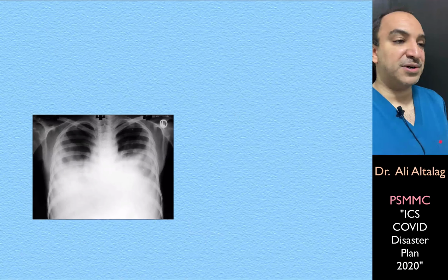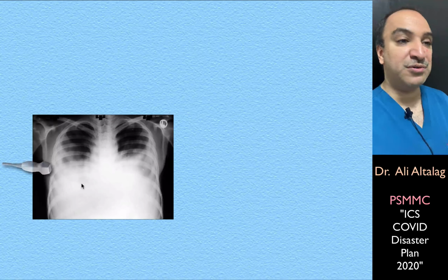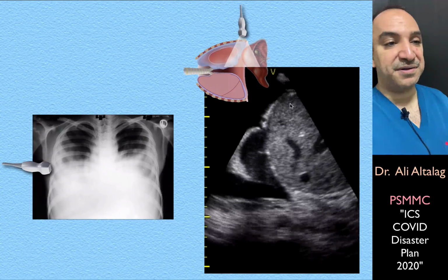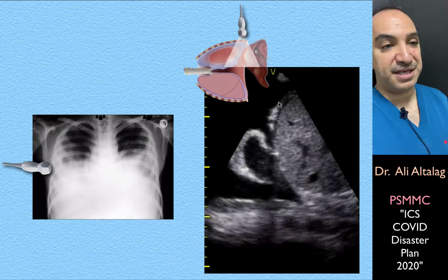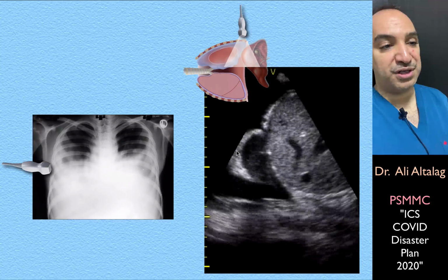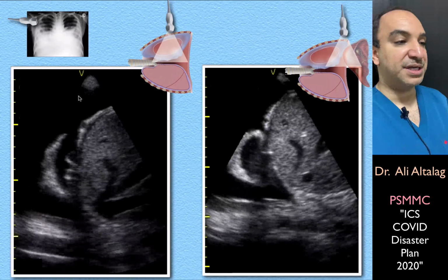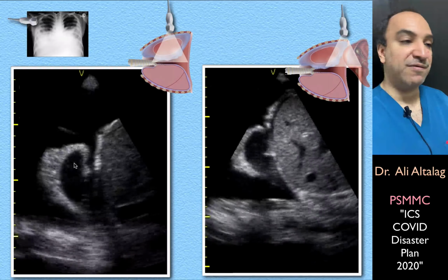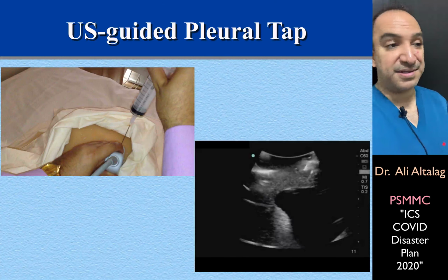Now, this is a patient of ours in whom there is what looks like bilateral pleural effusion. And when we put the transducer on the right side, we could see that there is the liver, this is the diaphragm, and this is fluid between the liver and the diaphragm in the abdomen. There is no curtain sign. What you see, in fact, is pleural effusion and collapsed right lower lobe here, as you see. So this is a large pleural effusion. So this is how pleural effusion looks. Sometimes the pleural effusion has certain densities that we will talk about later.